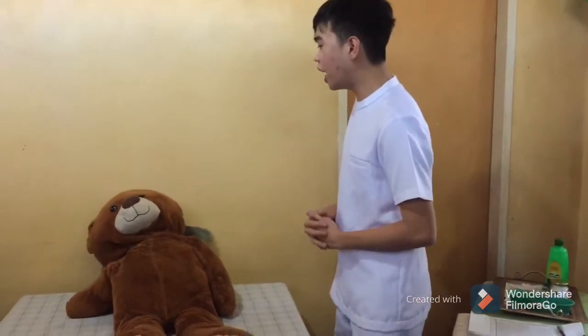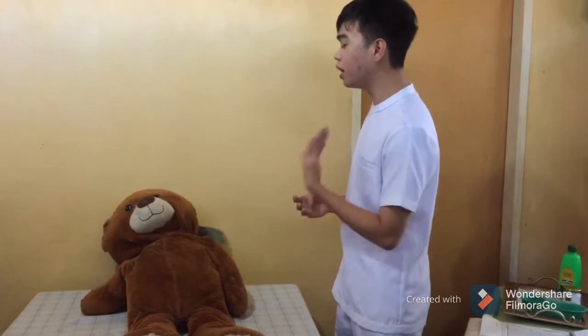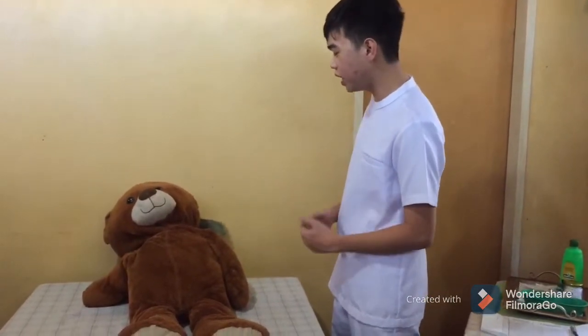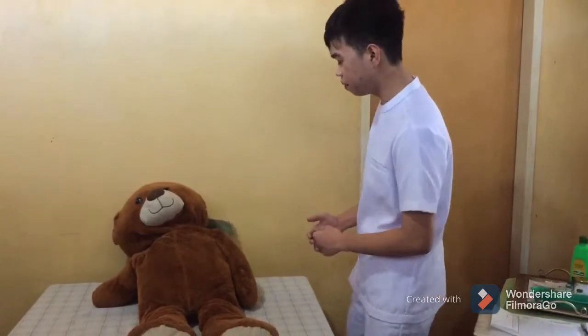Good morning, sir. I am your nurse for today. I am Nurse Robert James Torifiel. Sir, mag-skin test ta, sir. Okay lang sa iyo, sir? Okay lang bagunitan ako imong kamot, sir?